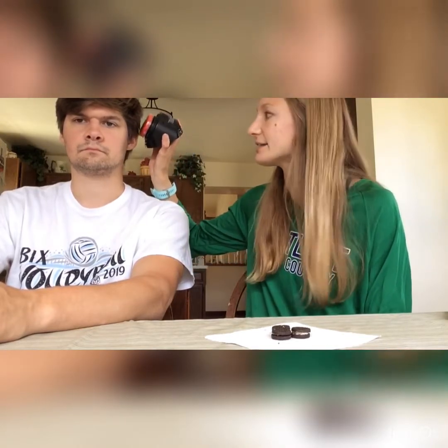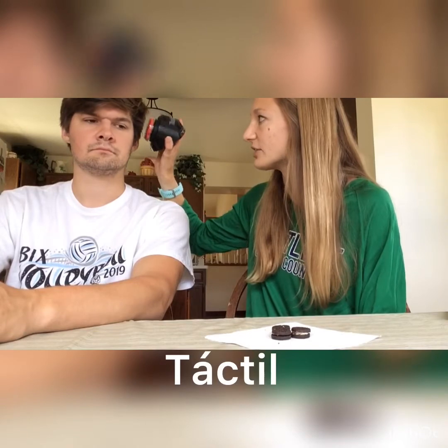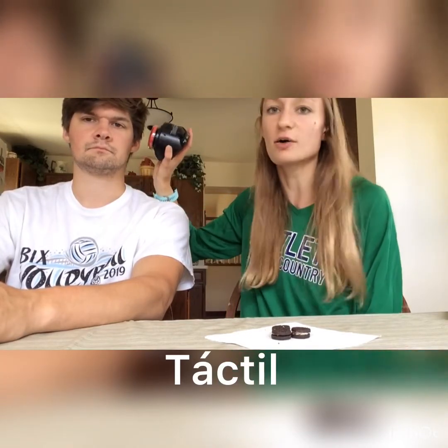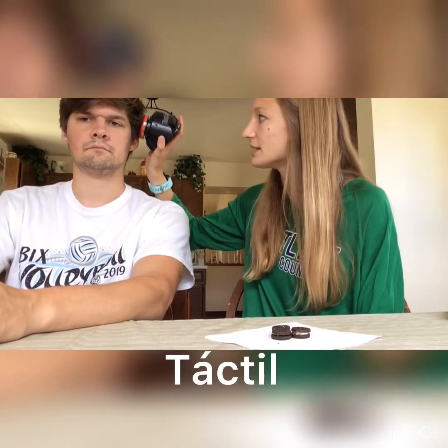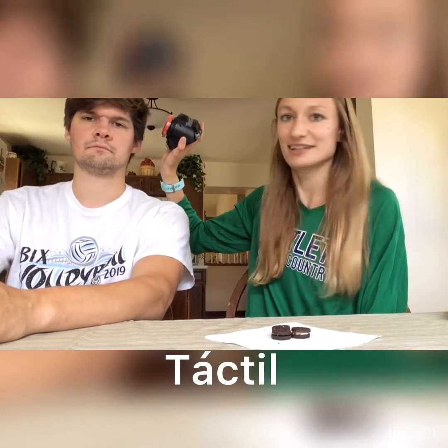So in that case, it's a little bit of a positional prompt too. You might move it a little bit closer and just let them know where it is on their head or in the back here, just so they can feel it. So I'll wait those 5 to 10 seconds. They didn't do it independently. I'm going to let them know where the switch is. Cookie. All right, and then hopefully they'll hit it from there.